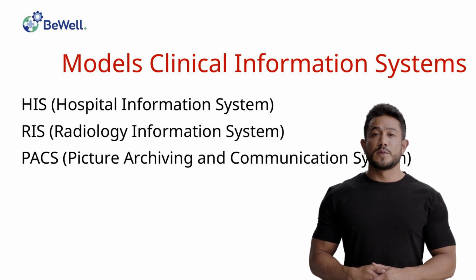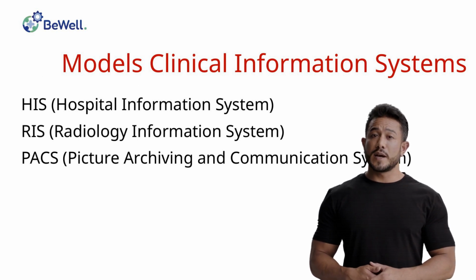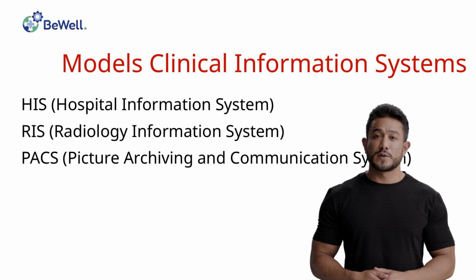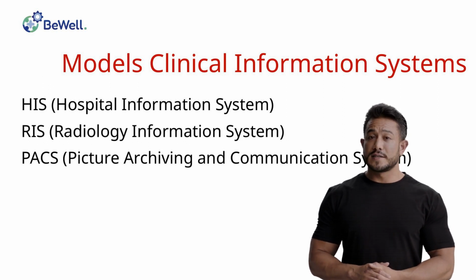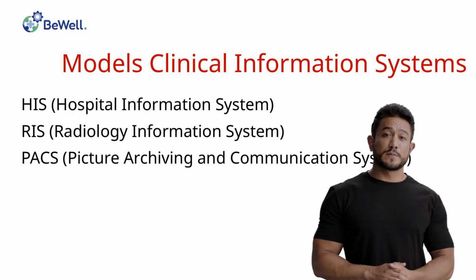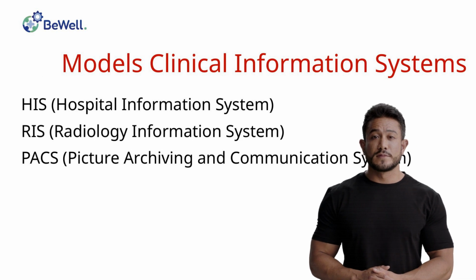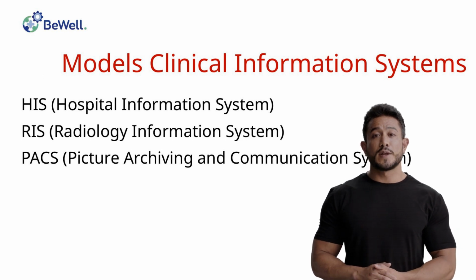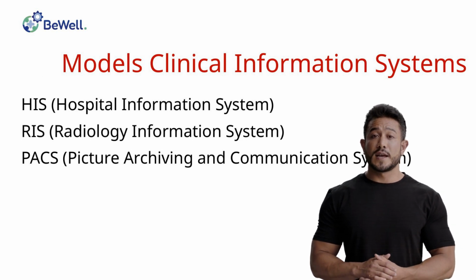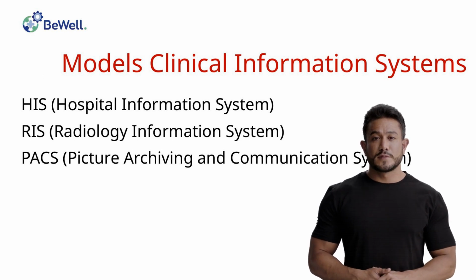HIS, Hospital Information System, an integrated set of computer tools used in healthcare to manage the administrative and clinical workflows of a hospital. RIS, Radiology Information System, a system used in radiology to manage the flow of data related to the reporting process. PACS, Picture Archiving and Communication System, a system used for the storage of images acquired from modalities, management of work lists, and access to images from reporting workstations.